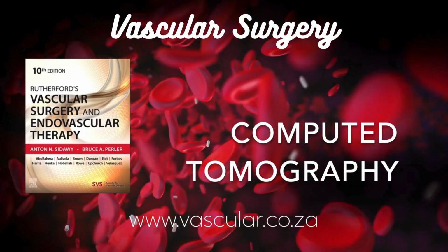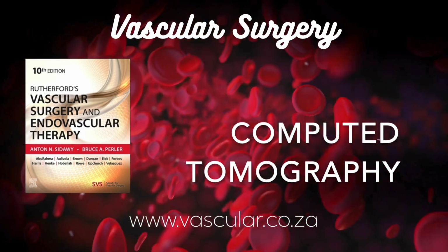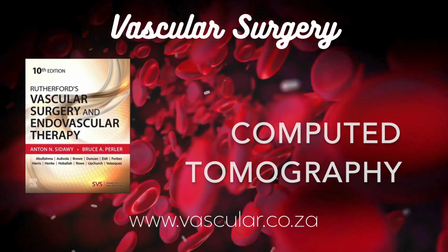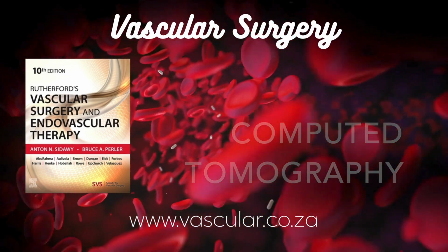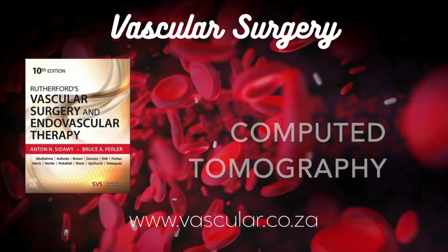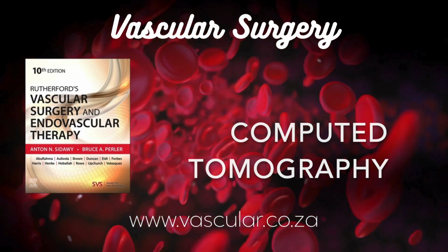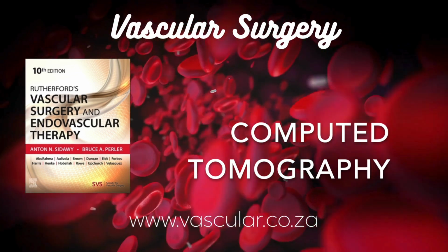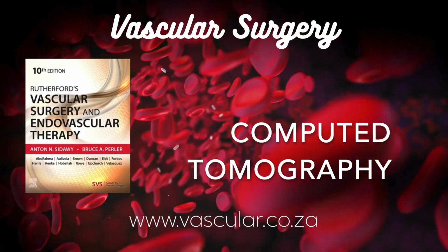Yep, critical pre-scan planning. You also briefly mentioned dual energy or dual source CT. Why isn't that standard for vascular yet? It's a really interesting technology. It uses two separate X-ray tubes, or one tube rapidly switching energies. It can give you more information about tissue composition, like differentiating iodine from calcium sometimes. Sounds useful. It can be, but it's also more complex hardware, more complex reconstruction, and often sophisticated software on modern single-source scanners can achieve similar diagnostic results for many routine vascular questions without that added complexity. It's finding its niches, but not quite mainstream for all vascular work yet.